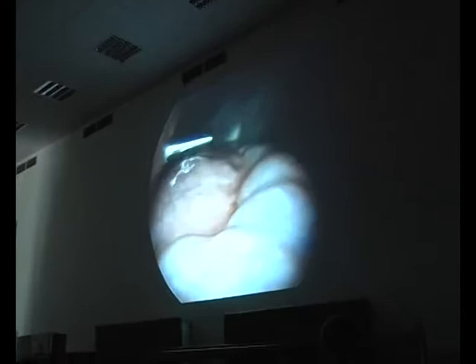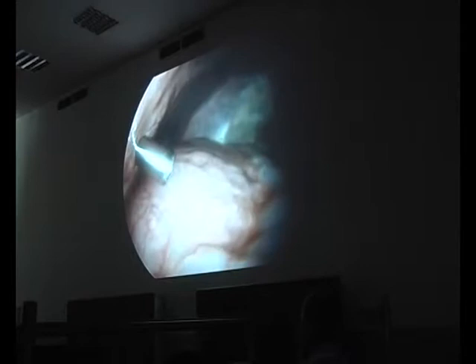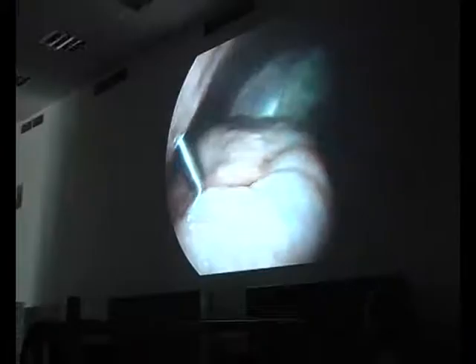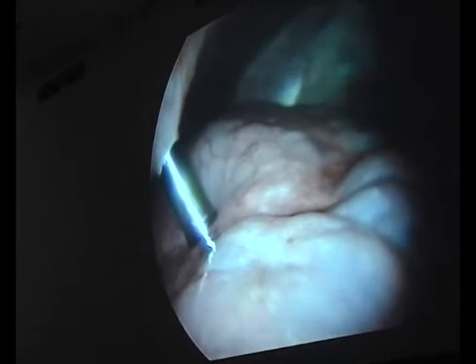Here is in the front of the spleen and, I think if you pull it a bit more to the back, you can see this is the top of the abomasum, and I just turn here at the edge of the omentum, and then you puncture, and now it's inside. You take out the mandrin, I put on my finger, yes, because otherwise the abomasum sinks down. Now the toggle is inside, and it goes down.